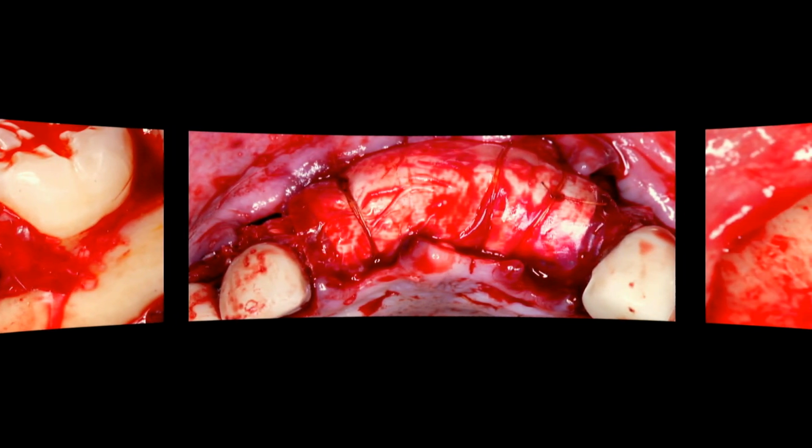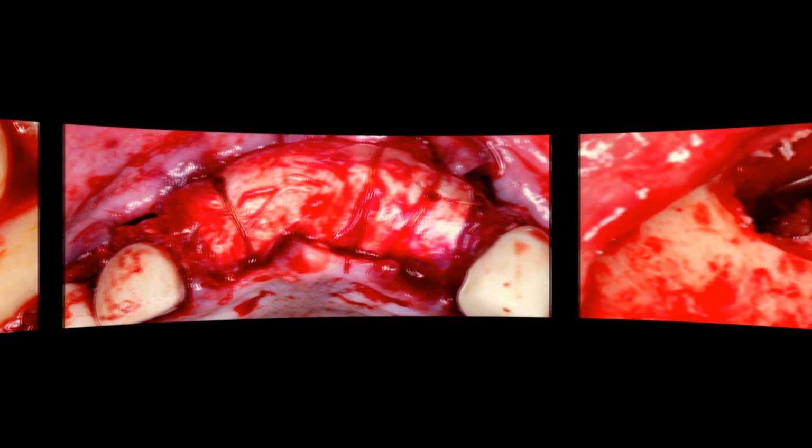I do this quite a bit. I'll use the Amnion-Chorion in addition to a collagen membrane, okay? In this particular case, which we'll go through in a little bit, I actually wasn't planning on doing it, but if you notice, I over-trimmed my collagen membrane, so my bone graft was sort of squirting out the sides. So to be able to have another membrane that just lies right over the top worked really, really well.